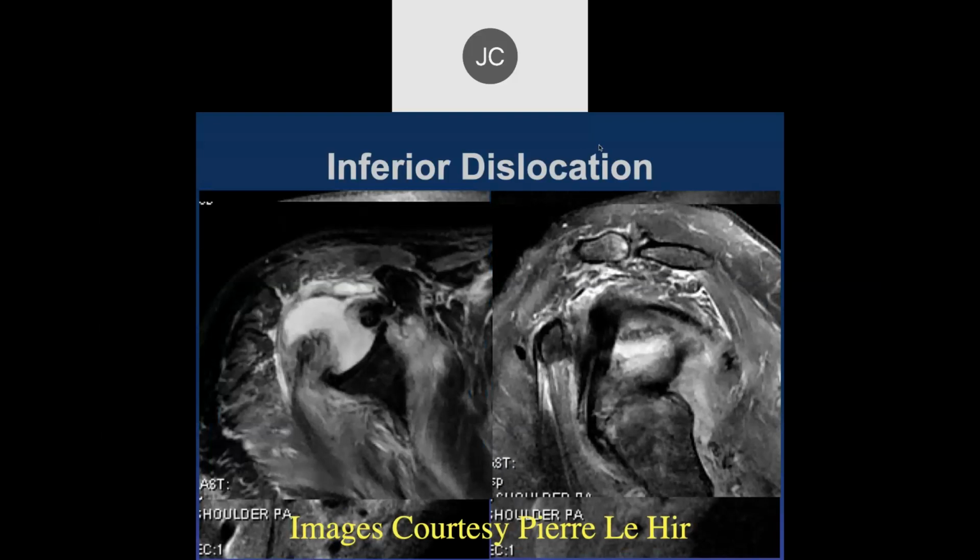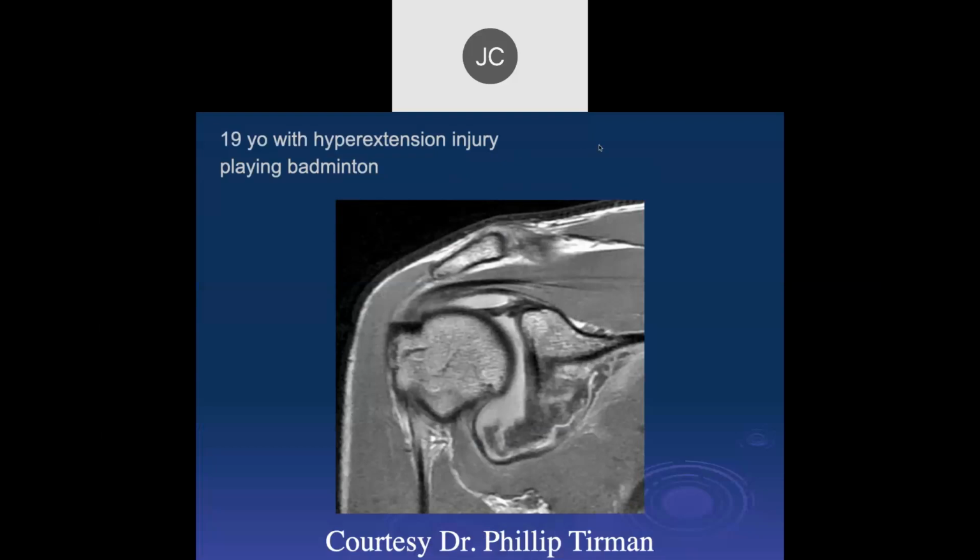And so we're still talking about shoulder instability. Taysom, why don't you take this one?